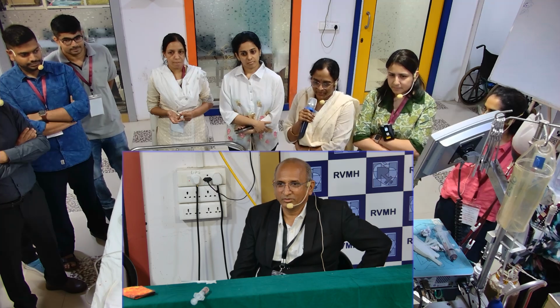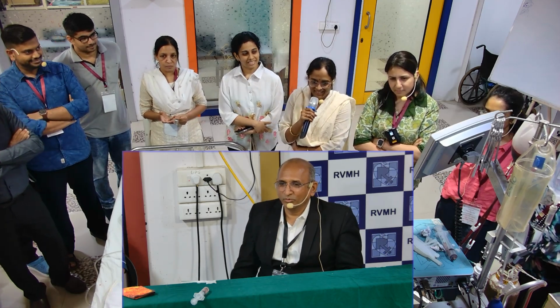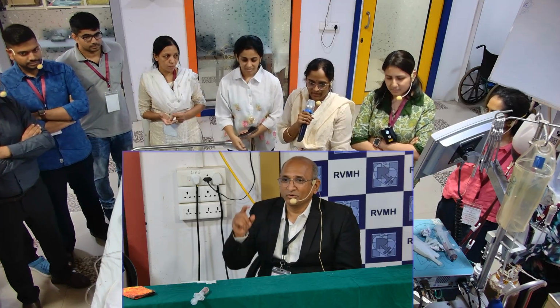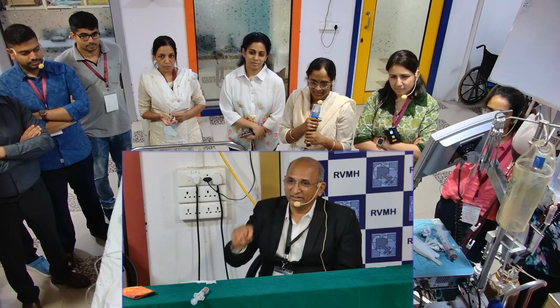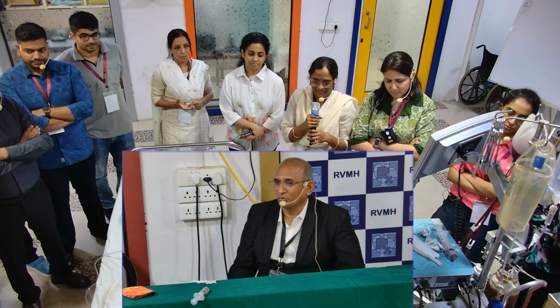But be more specific. What you are saying is generalized terminology. What do you want to say in this case? Because we missed the humidifier. So don't miss the humidifier or filter in the circuit. Don't take it for granted that it is working. If you want to, change everything.